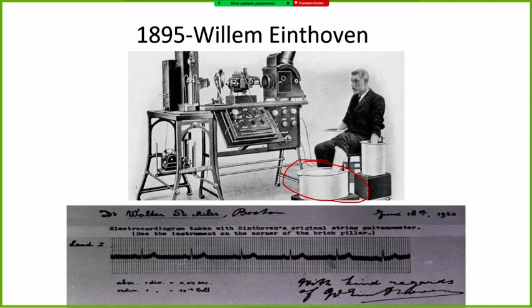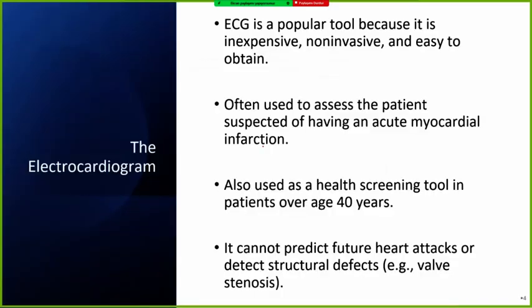And today we have electrodes with silver molecules inside, so the conductivity is quite high. But back in the 1900s, they didn't have the advanced electrodes as we have today.